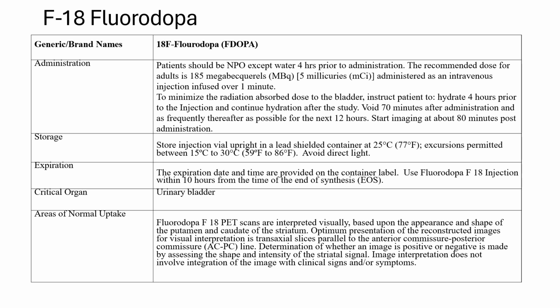Determination of whether the image is positive or negative is made by assessing the shape and intensity of the striatal signal and comparing both sides bilaterally. Image interpretation does not involve integration of the image with clinical signs or symptoms.